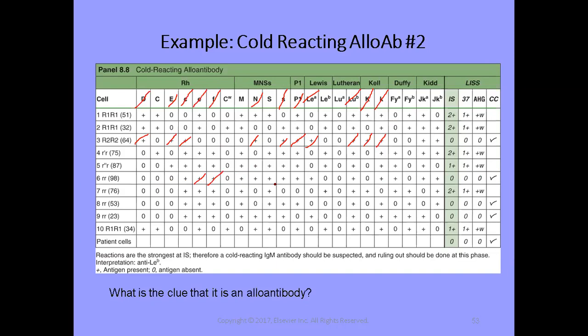Can't get rid of M, can't get rid of big S. No to LEB, no to LUA. Duffy A. And nothing there. Okay, so we'll go here. Okay, we'll get rid of M on this cell. Nothing.